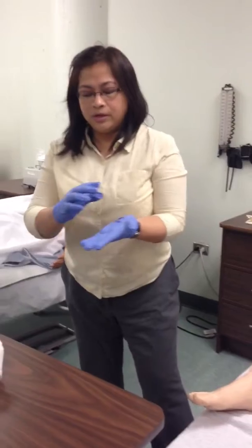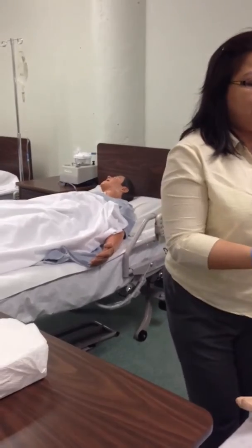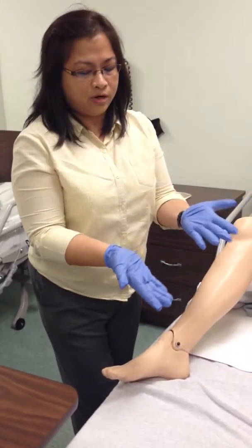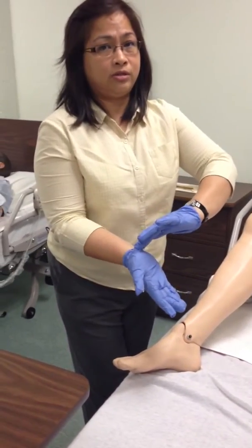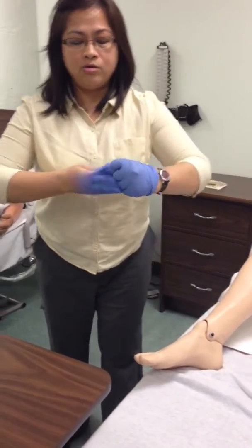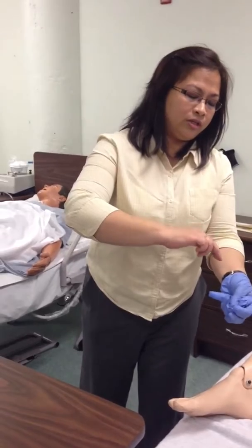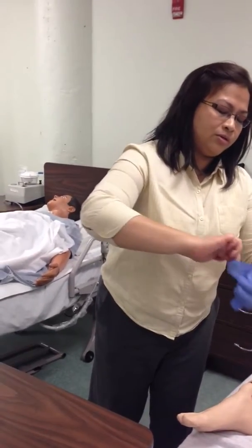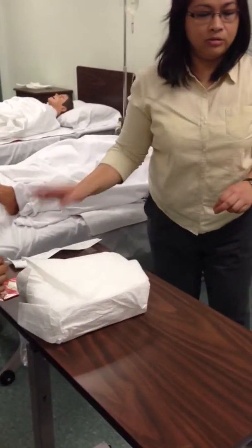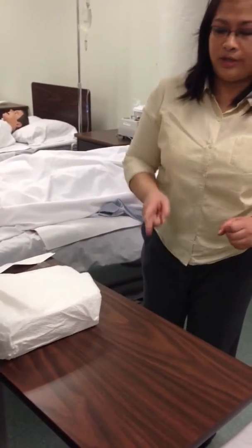Okay. All right, so all gloves are removed properly because if you have blood over here or mucus or whatever body secretions, you don't want to contaminate your skin. If you go like this, you're gonna touch your skin. So you need to pinch it over here, pull it, all right? Do not touch the outer part. And then you bunch it in there, and then you use 2 fingers. All soiled gloves are removed like that. So you throw that, you wash your hands, okay? So twice you need to wash your hands, okay?